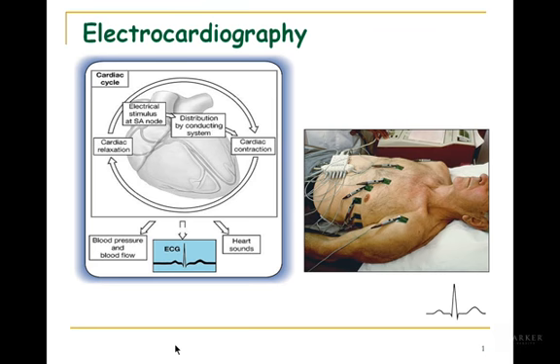What we're going to get when we use an ECG is we're looking at voltage gradients that are created as myocardial cells sequentially depolarize and repolarize, that are the electrical activity created by this. It's transmitted up to the body surface where we attach these surface electrodes, which is then attached to a machine, and we can record this. What you're going to be able to see is it's going to indicate direction, it'll indicate magnitude of this electrical activity, and it's plotted against time.